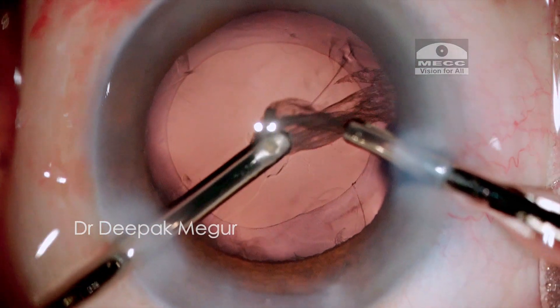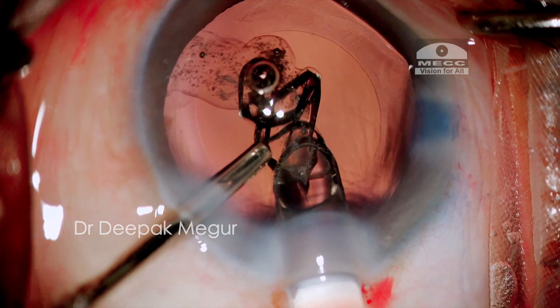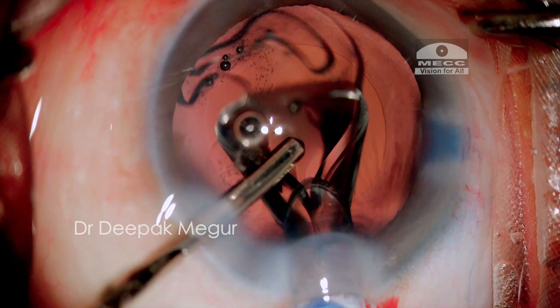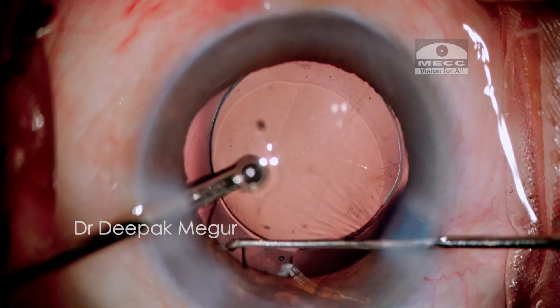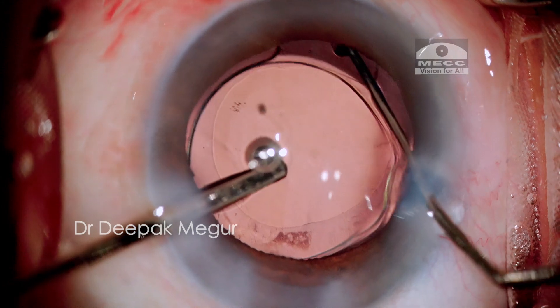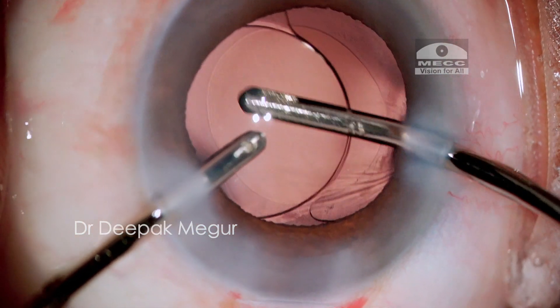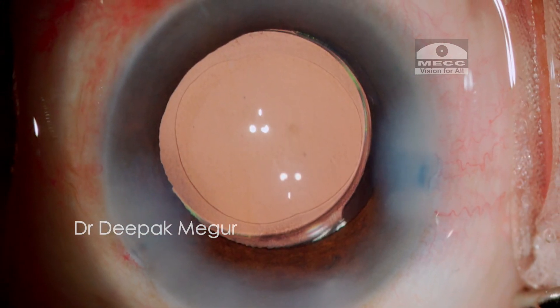Finally, it's time for implantation of the lens. I'm using a hydrophilic lens in this case, implanted into the bag using the hydro-implantation technique, wherein irrigation maintains the anterior chamber and the bag, and the lens is gently implanted into the bag. That's it — the case is done. I hope this video was helpful. Thank you for your time.